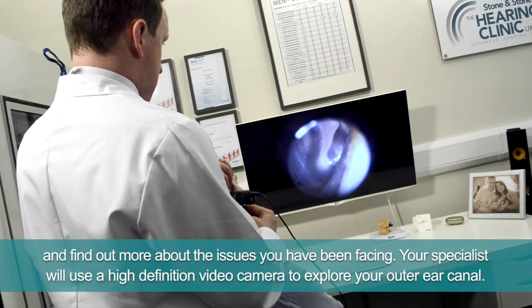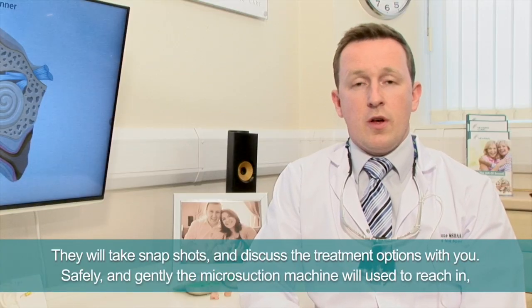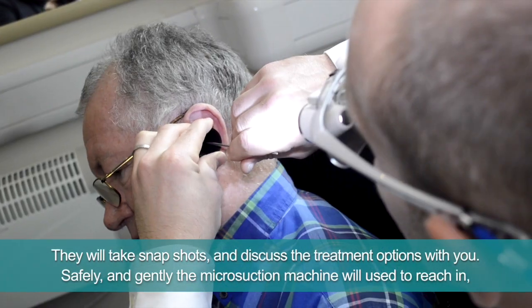Your specialist will use a high definition video camera to explore your outer ear canal. They'll take snapshots and discuss the treatment options with you.